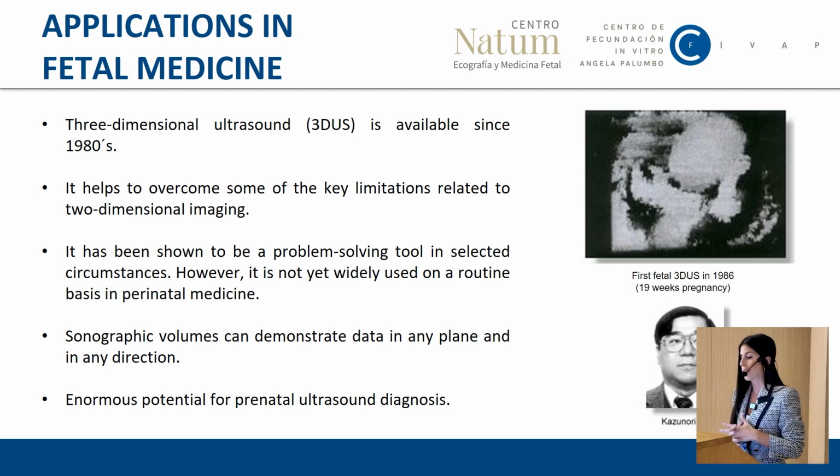It's true that 3D ultrasound helps to overcome some of the key limitations related to imaging. It has been shown to be a problem-solving tool in selected circumstances. However, 3D ultrasound is not yet widely used on a routine basis in perinatal medicine, and the role of 3D ultrasound is still being evaluated in many areas. Obtaining sonographic volumes rather than simple slices allows us to demonstrate data in any plane and in any direction, and this ability has enormous potential for medical ultrasound diagnosis.